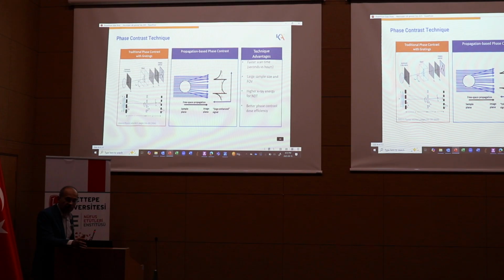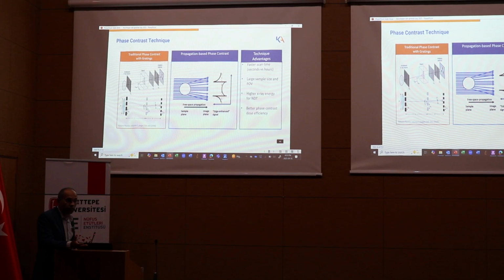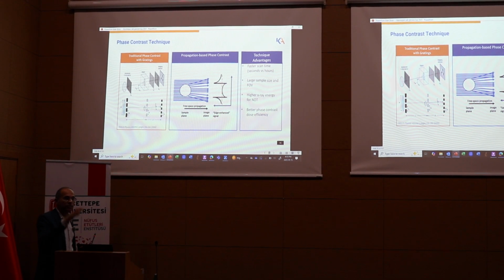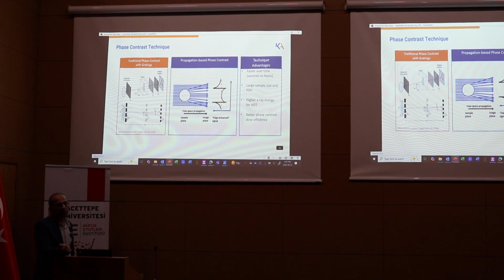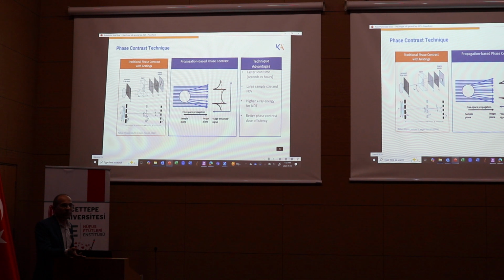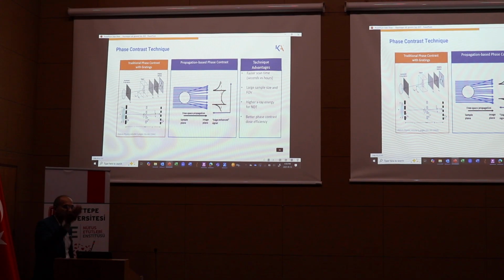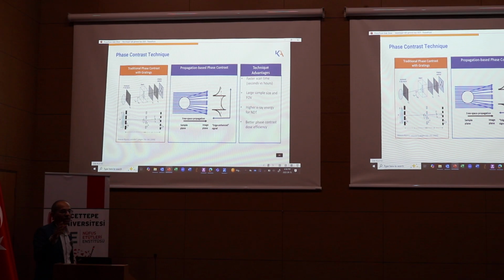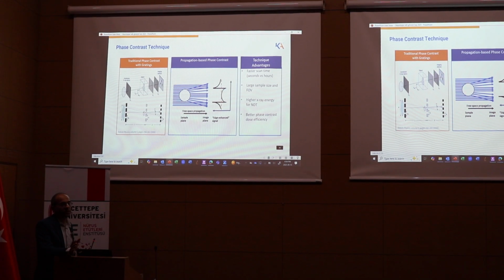And it just so turns out that if you look at amplitude, X-ray is good for materials that are very dense with high atomic number, like calcium or steel, because the amplitude variation is easy to detect. But if I took an X-ray and I ran it through glass or water, the amplitude doesn't change at all. So actually you cannot tell if you're going through glass or water with an X-ray because the amplitude stays roughly the same, especially if it's thin glass. If it's very thick glass and it's got like borosilicate, yeah, maybe you can see it. But like fiber optic or like very thin glass, you're not going to be able to see it.